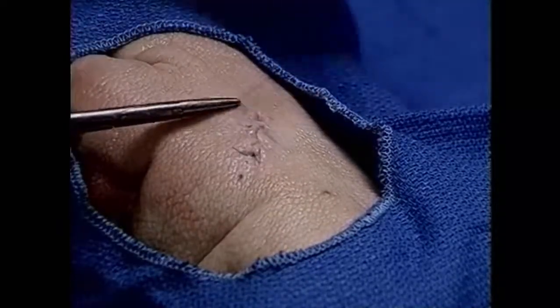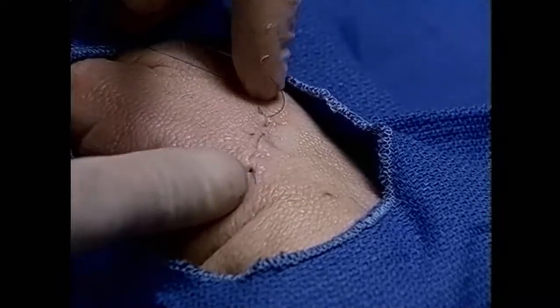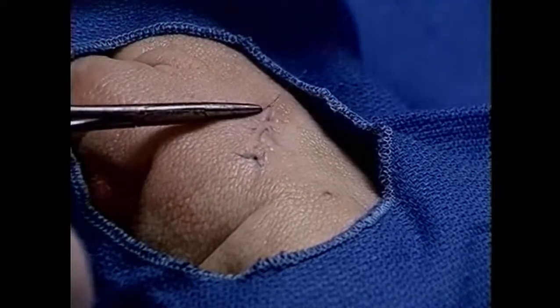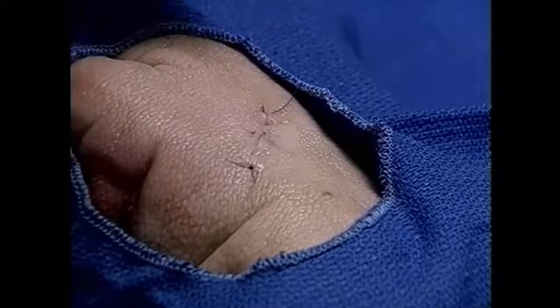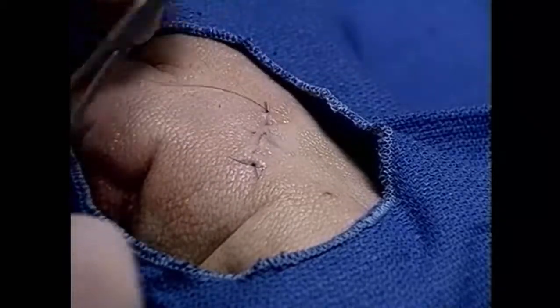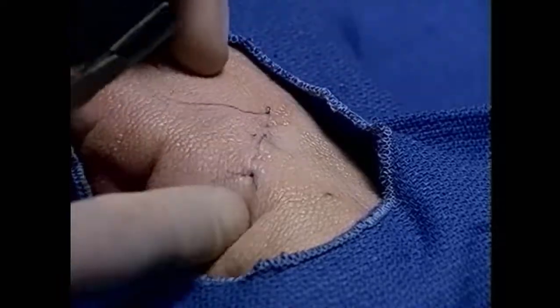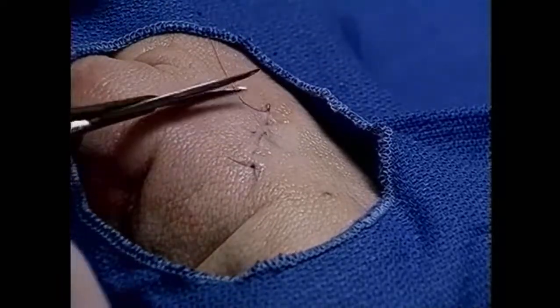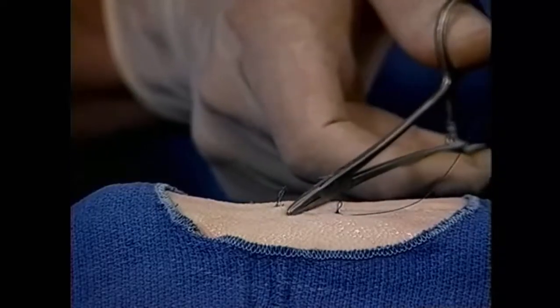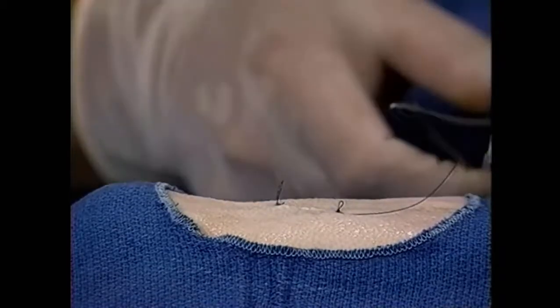The same procedure is repeated on the opposite side. You can stretch it out until you have just the right amount of tension on both sides, and this loop can be made a bit larger if you wish, but it isn't necessary. And that is a subcuticular stitch. Steri-strips can be placed across the surface if needed, but frequently they are not needed.